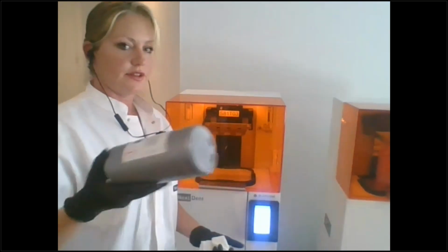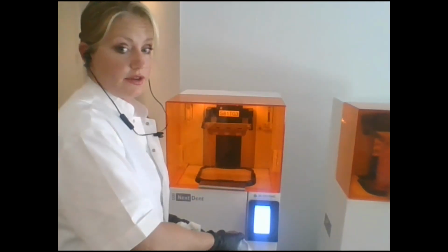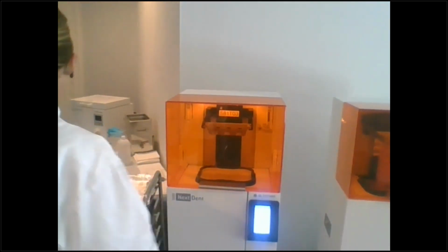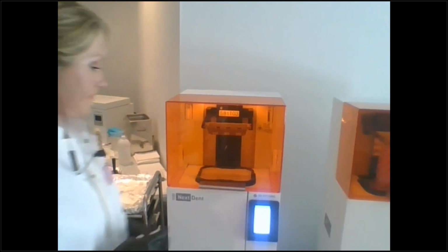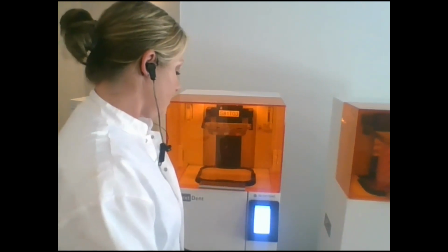And a slight angle is fine. There's nothing real special to it. Just take it at a slight angle and it'll find it. It'll tell you how much is left in the bottle, what the lot number is, what the expiration date is, and it'll tell you to confirm a few things.